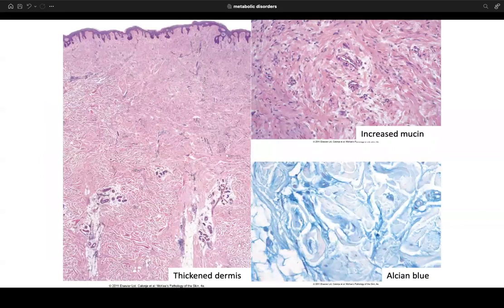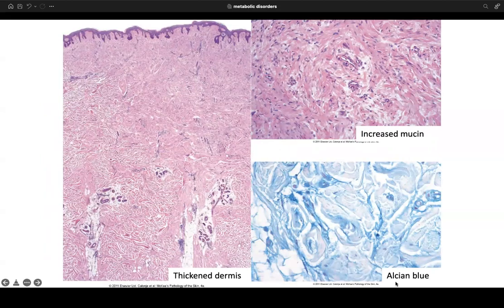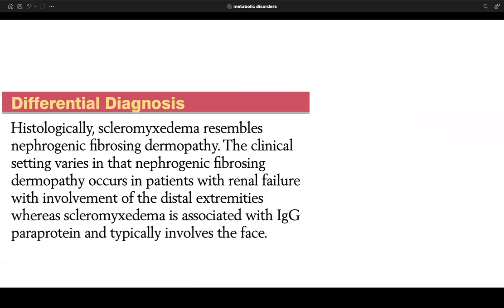Higher power of scleromyxedema shows mucin, spindle cells, and increased collagen. Alcian blue highlights the mucin. Scleromyxedema resembles nephrogenic fibrosing dermopathy histologically; clinically, nephrogenic fibrosing dermopathy occurs in renal failure and involves distal extremities, whereas scleromyxedema is associated with IgG paraproteinemia and typically involves the face.